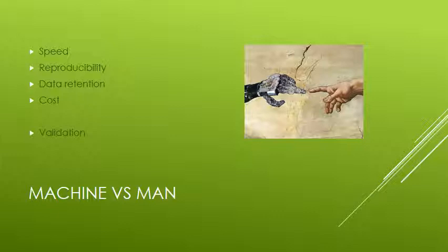Now, no matter what you do, when you're talking about bringing in a new machine, validation is key. You must undergo validation in order to bring in any machine. And what validation is, you compare the instrument, the new procedure, against three things.